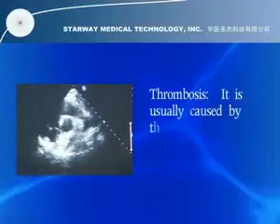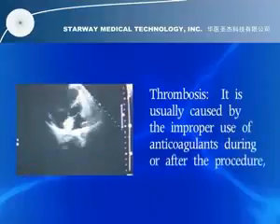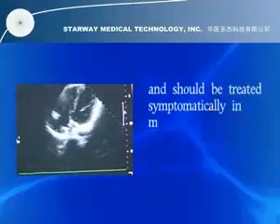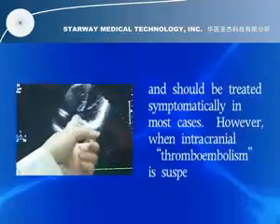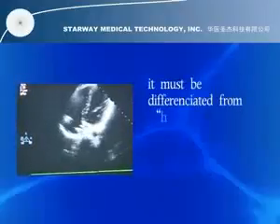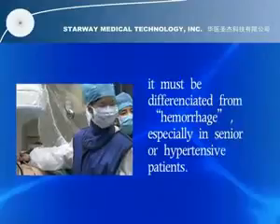Thrombosis. It is usually caused by improper use of anticoagulants during or after the procedure and should be treated symptomatically in most cases. However, when intracranial thromboembolism is suspected, it must be differentiated from hemorrhage, especially in senior or hypertensive patients.